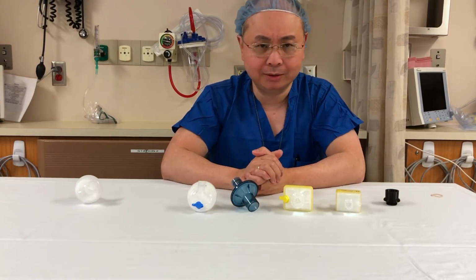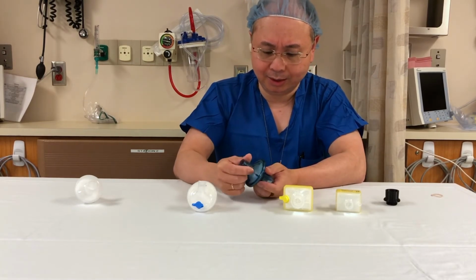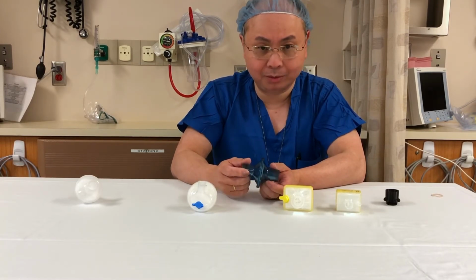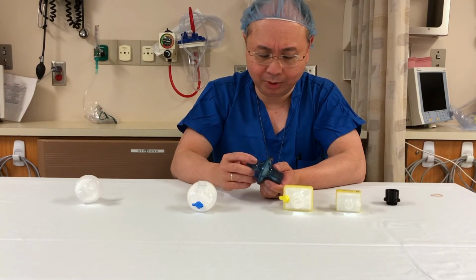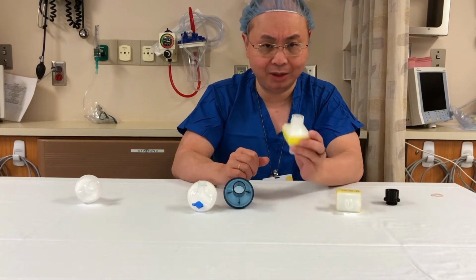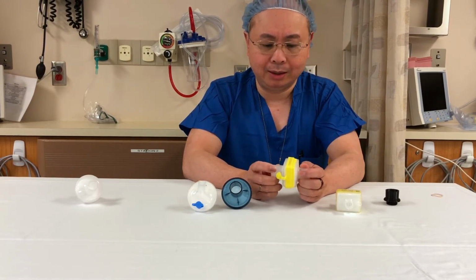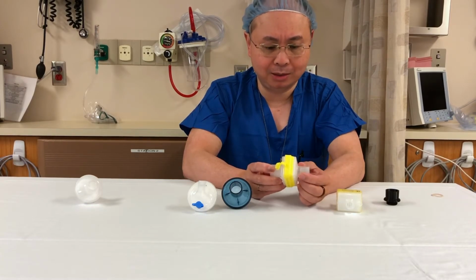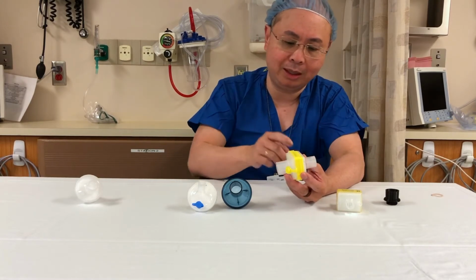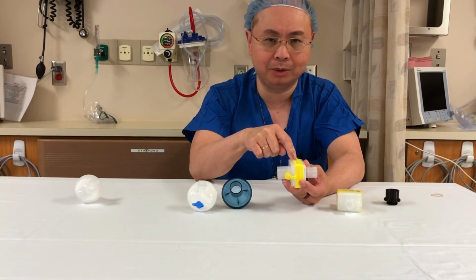Now, in these times of shortages, using up filters in a responsible manner is reasonable. If you look at the specifications by the manufacturers for the usage of these filters in a ventilator circuit, they say about 24 hours of use is safe. And that does make sense because when we put them in a ventilator, we're using them bidirectionally, and we're also keeping the filter element quite humid during the entire time we're using it.